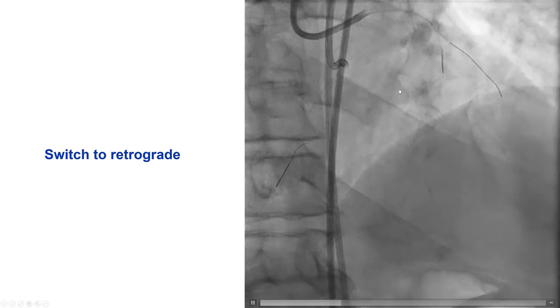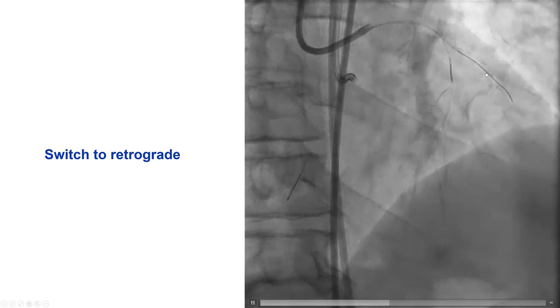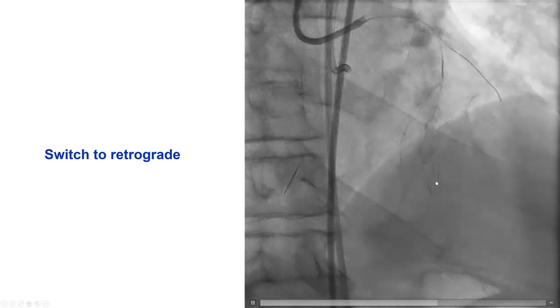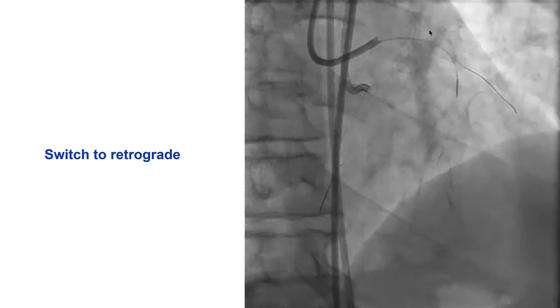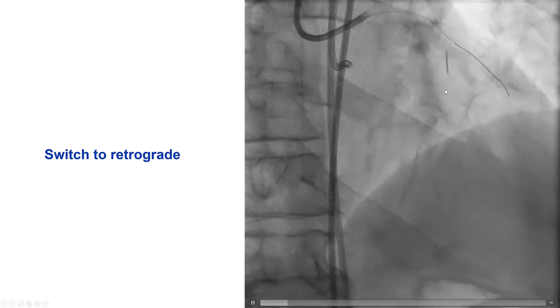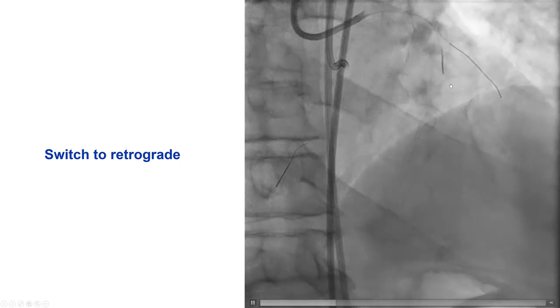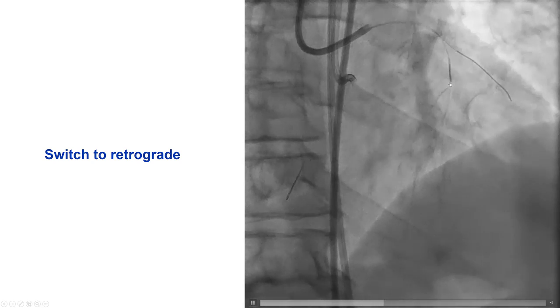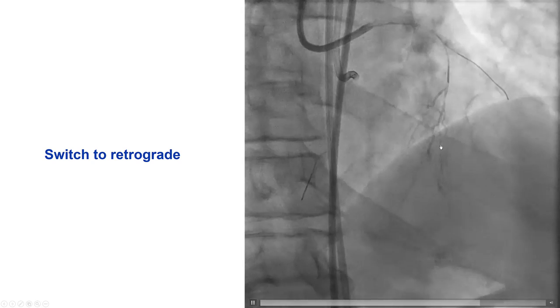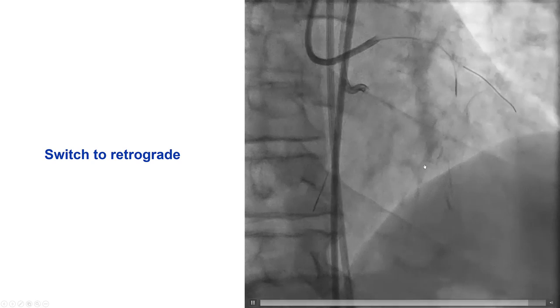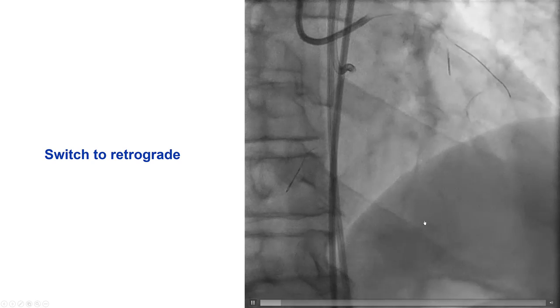Based on that, we decided to switch to retrograde. We did surfing through the septal branch but could not make it connect. After injecting contrast, it became apparent that there was no continuous connection of the septal branches with the PDA.